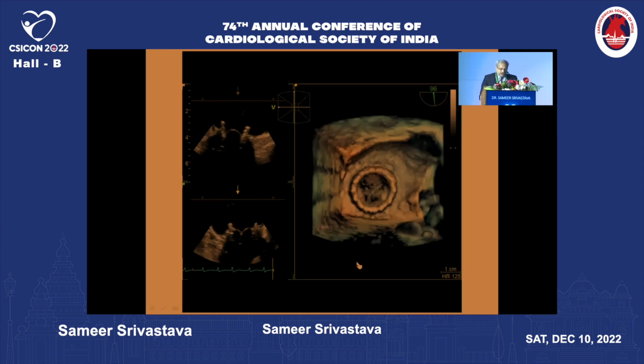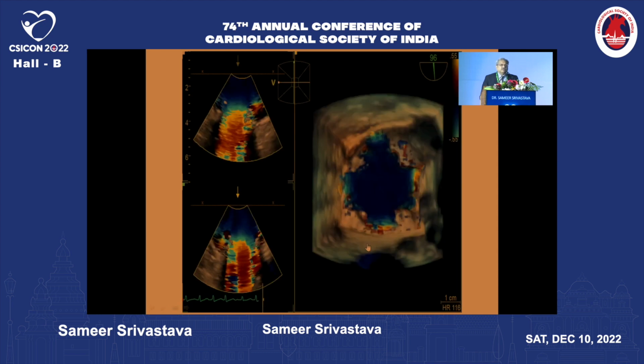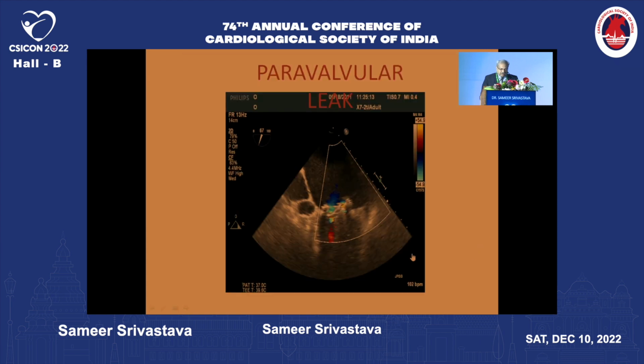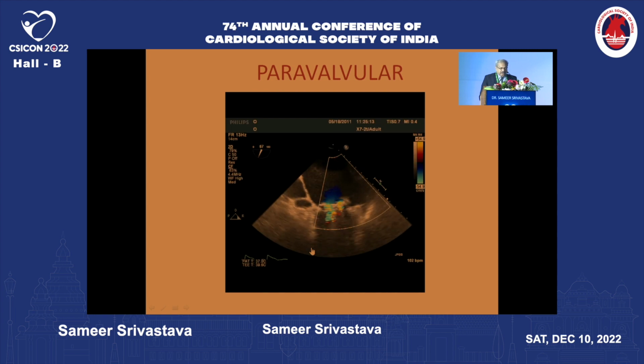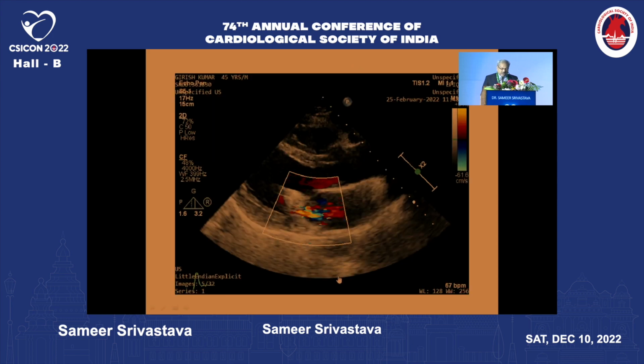You can go ahead and check on paravalvular leaks. Not only this, you can check on other mitral valve pathologies, not necessarily TEER, but here if you look at it, these are good jobs when people have done this. This is something which I just wanted to add on, that paravalvular leaks can also be plugged very well. And again, if you are satisfied it is nothing significant, the problem comes when you are not satisfied with this.